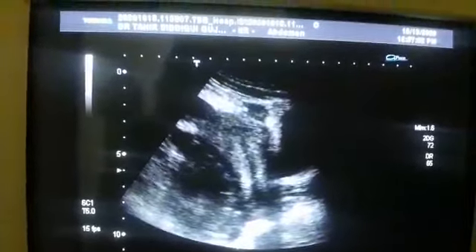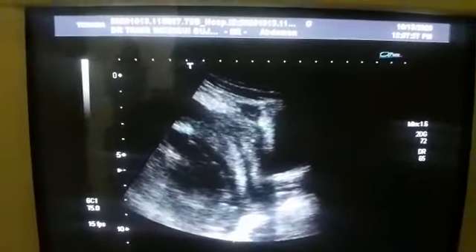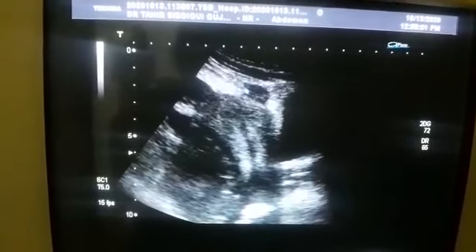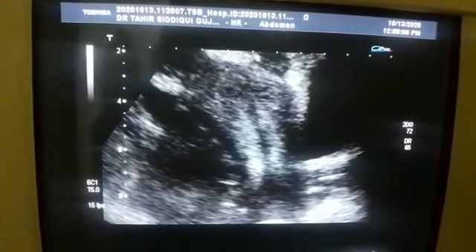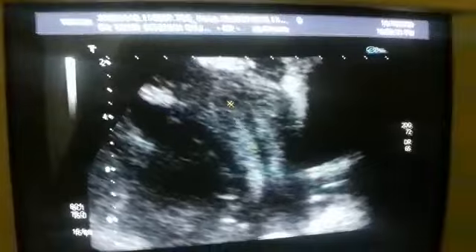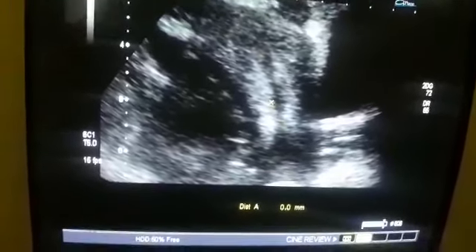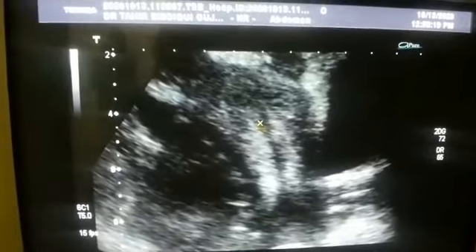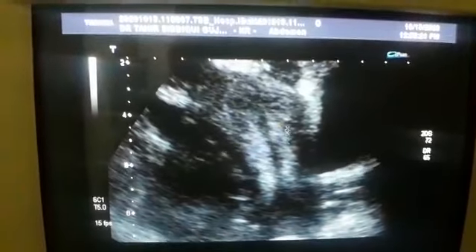Now this is a gynecological pathology of a young patient. She got pregnant 9 months after her marriage, and then by a doctor's suggestion, she had to go through DNC, not only once, rather twice, for a reason that is unknown to the patient. Anyways, this is the uterus.